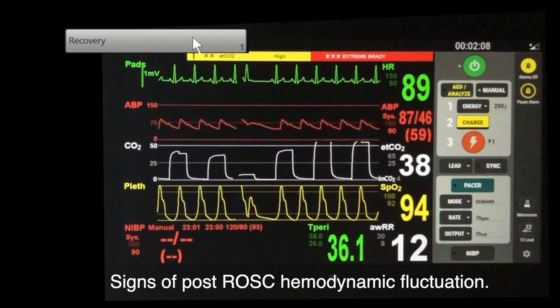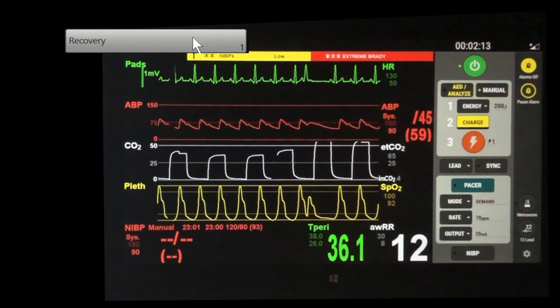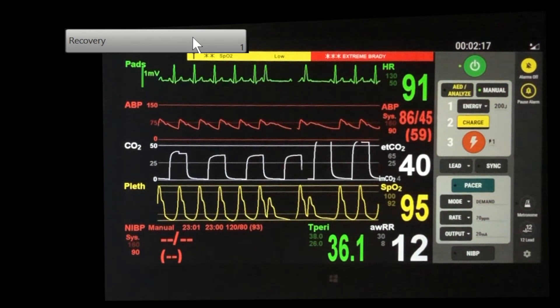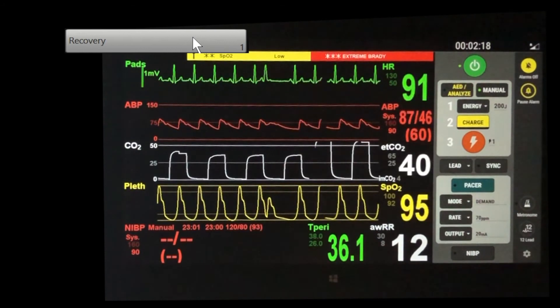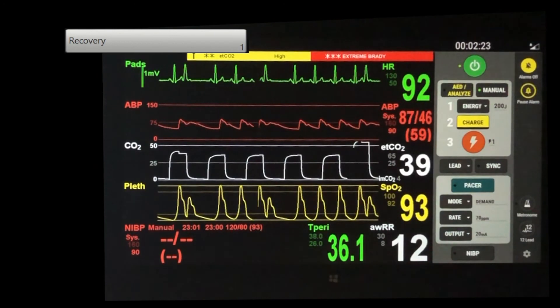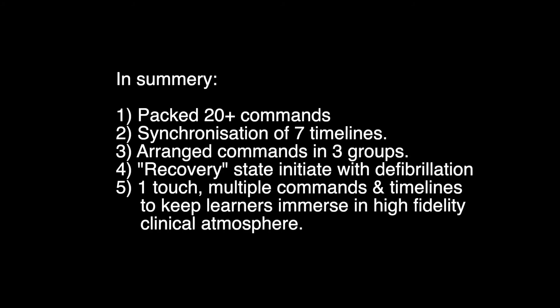This short video has just demonstrated a programmed simulation state which is packed with three subgroups of more than 20 commands and seven synchronized timelines. The state is activated by defibrillation. In summary, one touch, multiple commands and timelines keep the learners immersed in the clinical atmosphere.